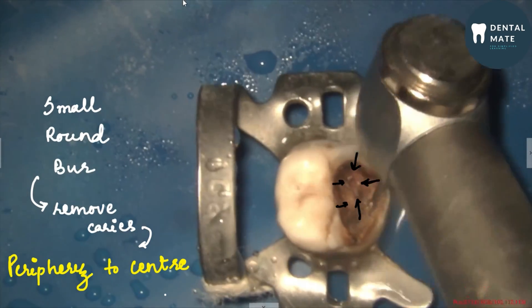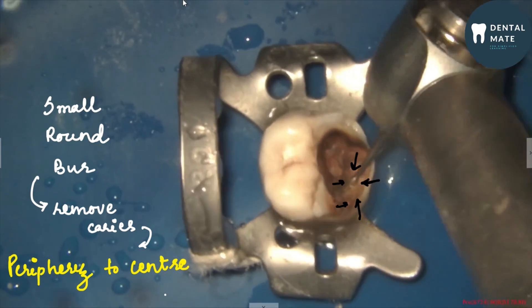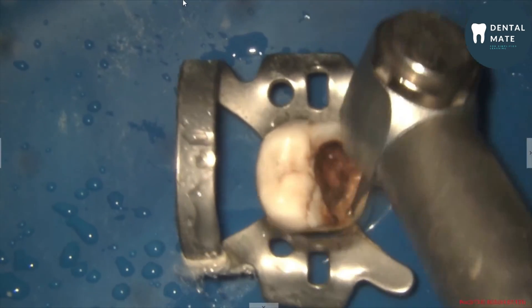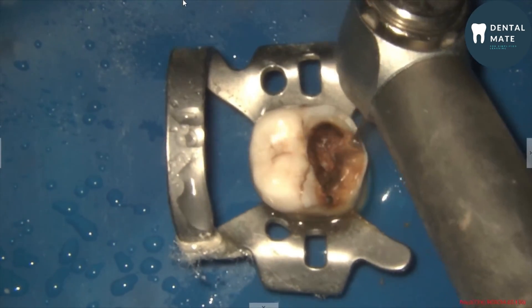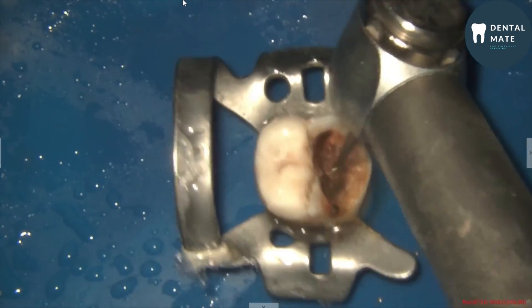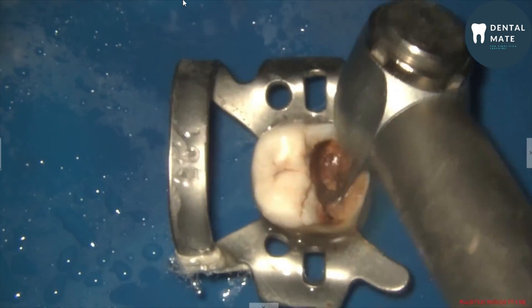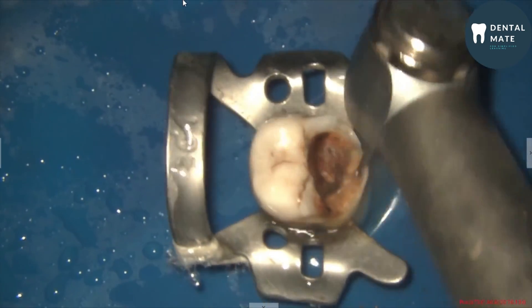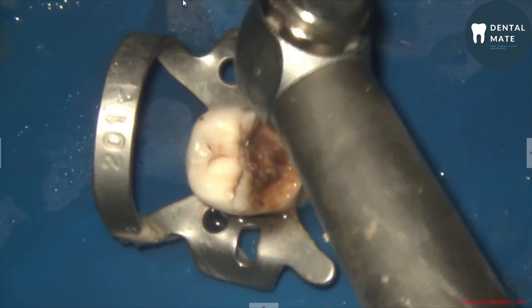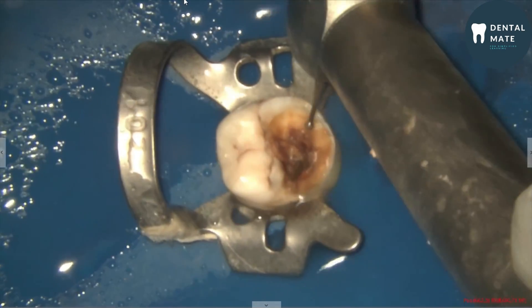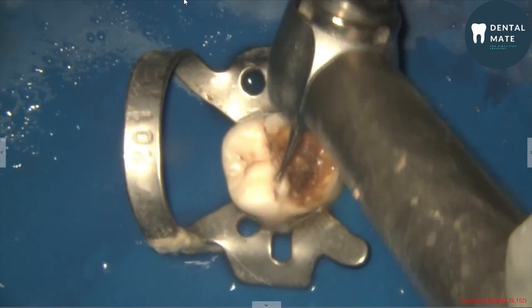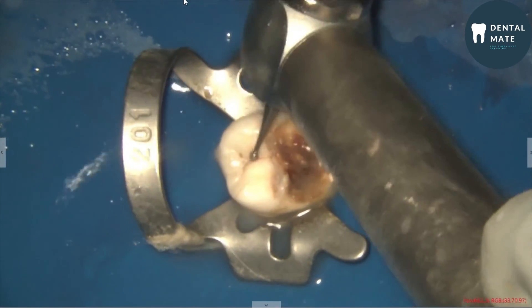We start with a small round burr to remove the caries. Caries has to be removed always from periphery to the center, so first we remove all caries present in the periphery with a small round burr. For the small round burr, the working direction can be directed apically. But whenever we switch to the EX-24 or the safe-end burr, the burr has to be operated in a lateral cutting direction and not in an apical direction.